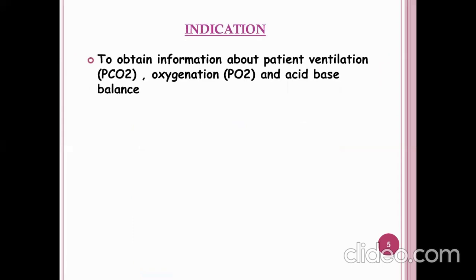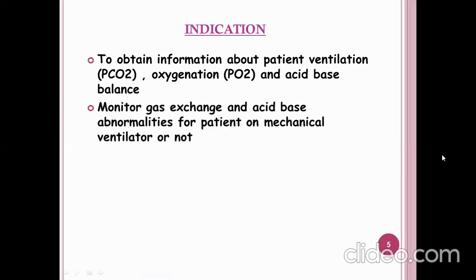So what are the indications? Indications are to obtain information about patient ventilation, that is PaCO₂, and in the case of oxygenation, PO2 and acid-base parameters, and to monitor gas exchange and acid-base alterations for a patient on a mechanical ventilator or not.